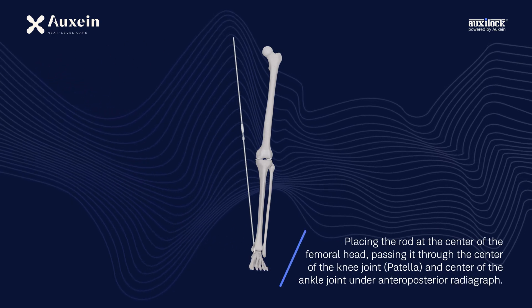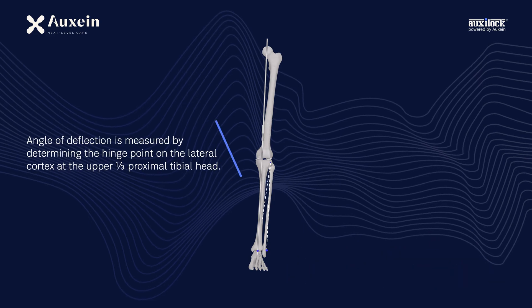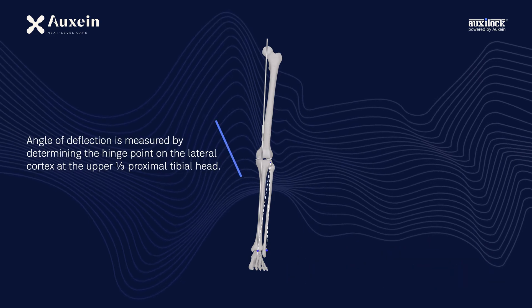Placing the rod at the center of the femoral head, passing it through the center of the knee joint, patella, and center of the ankle joint under anteroposterior radiograph. The angle of deflection is measured by determining the hinge point on the lateral cortex at the upper one-third proximal tibial head.